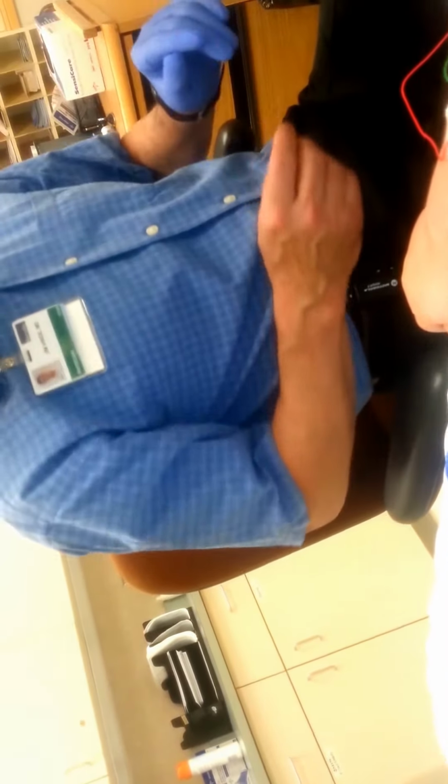All right. So let's select the exam. Let's go to studies. Let's now go to EMG. Let's start at the deltoid muscle. That gets its nerve supply from C5. So we're not going to give you any shocks. We're going to measure your electricity from within the muscle. What's that? Look, this hooks up to a needle.